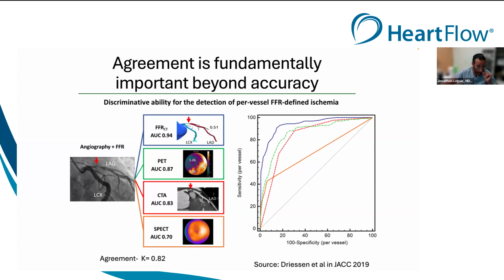The guidelines suggest that we should consider using FFRCT in a 40 to 90% stenosis, in a patient and a vessel we would consider for revascularization, to inform the decision around cath referral. But when we're informing that decision, we need to really understand what the interventionalist needs to know. She doesn't want to know if the LAD is likely normal or abnormal in a binary sense. She actually fundamentally needs to know whether or not the lesion itself is causing abnormal pressure, how abnormal the pressure is, and how the pressure falls off in relationship to the focal lesion.